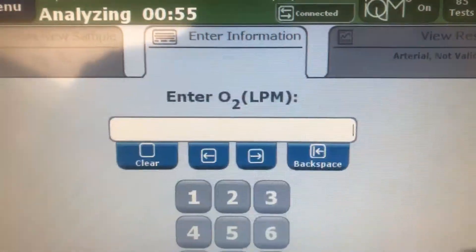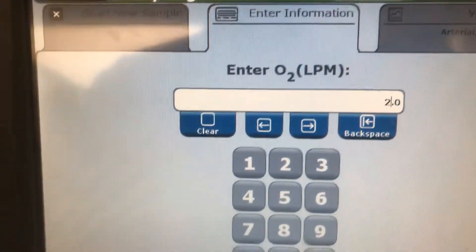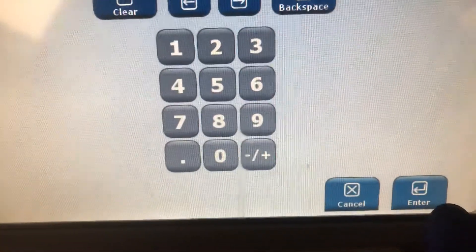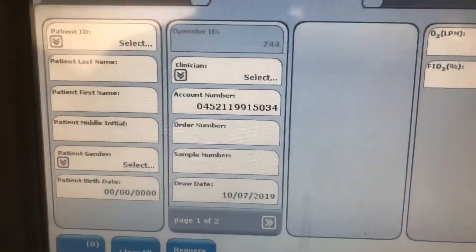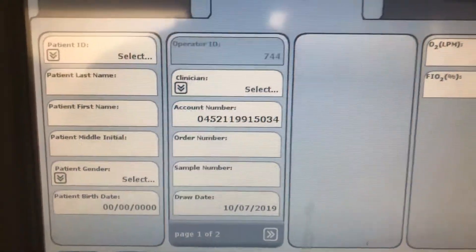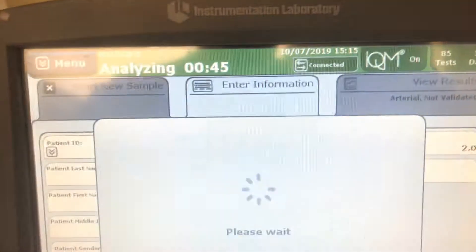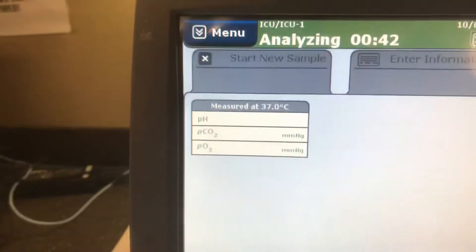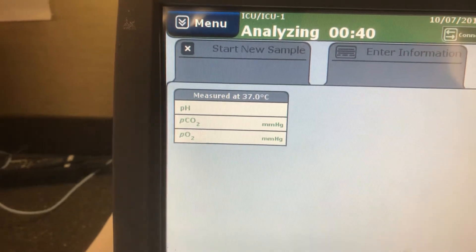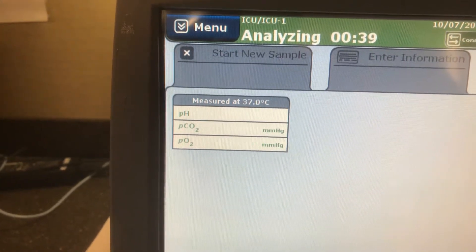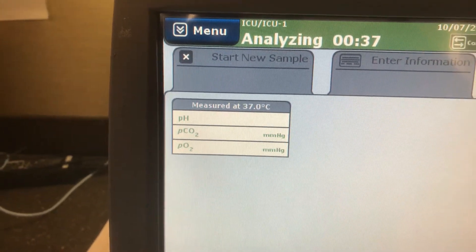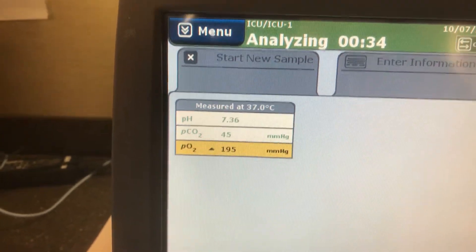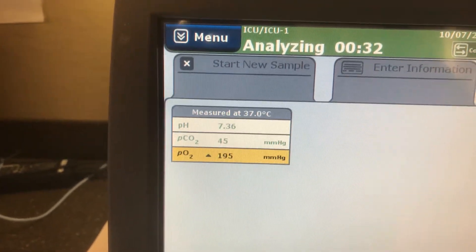Put in the FIO2 — you have to enter it or it doesn't report in the electronic medical record. Press enter and it will start processing. We can go to view results at this point.